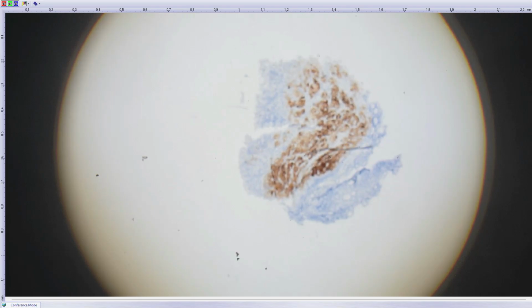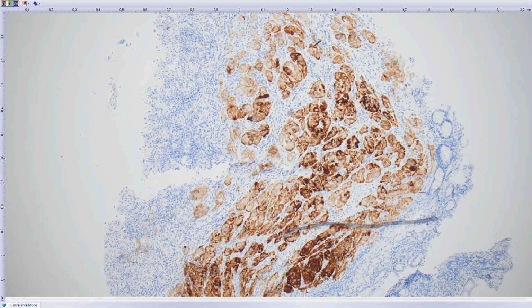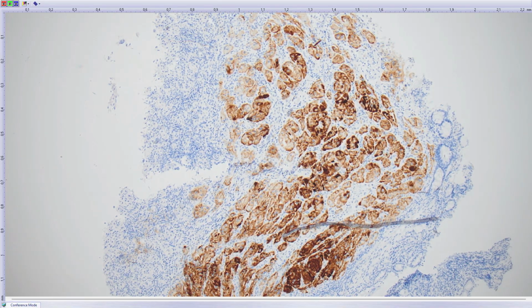from this immuno. This is melan A staining. So we've got a synaptophysin positive and melan A positive lesion. By the way, cytokeratins are completely negative. Is it an adrenocortical lesion? Yeah. So alpha inhibin was positive in addition, calretinin was positive in addition. Steroidogenic factor 1, SF1, was also positive.